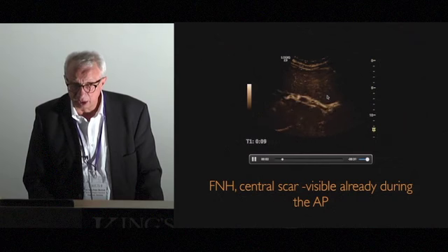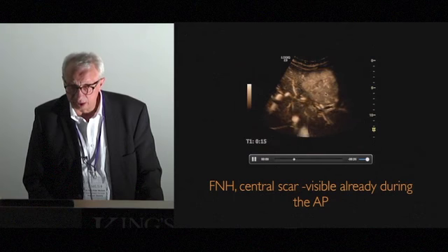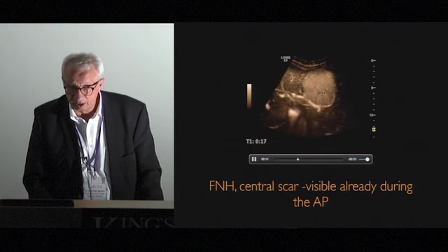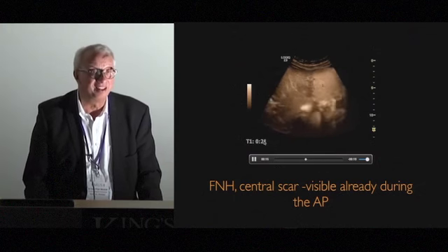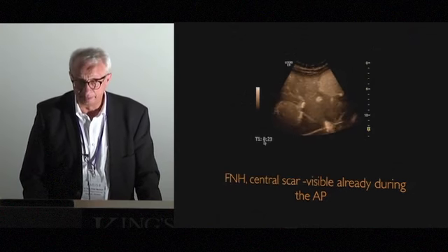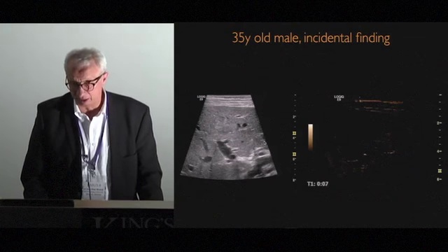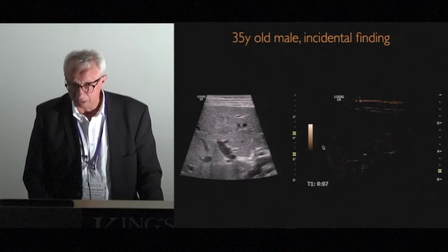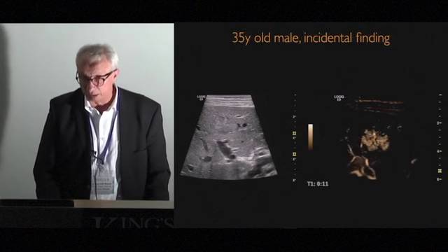Contrast is coming, and here is the central scar. Very nice to see during the arterial phase. We have 18 seconds now, and we can see it already. This is a male, also male patients have FNHs. And this is with a 9 megahertz linear probe.